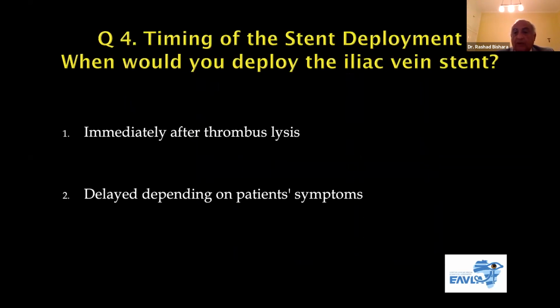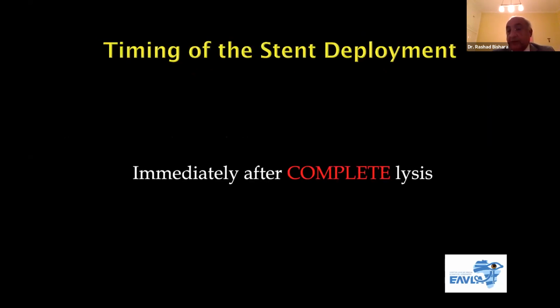All right, let's see the answers, please. Yeah, the great majority, 77%, would do it immediately, and 23% would leave it to see how the patients would do. Our policy is to do the stent immediately after complete thrombolysis. But again, this is after complete thrombolysis.